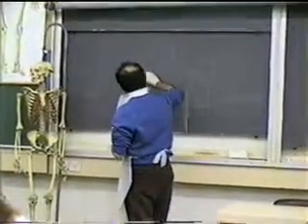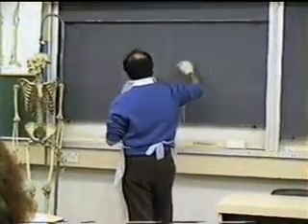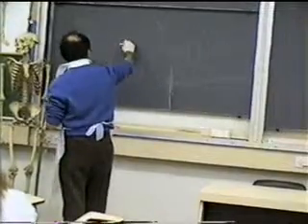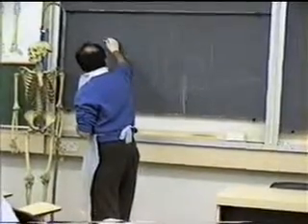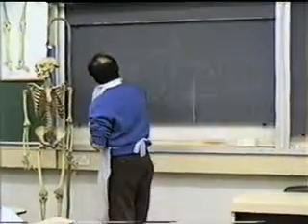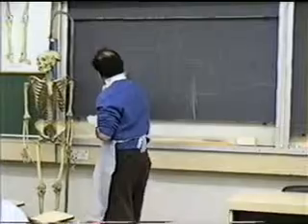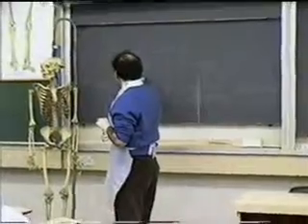These are the nasal bones. And this is the process of the maxilla. When you do an osteotomy like this, this is the inner canthus. You can have this kind. I start always like this, and then I move the chisel here. Or the osteotomy we showed Dr. Simons is a curved osteotomy.